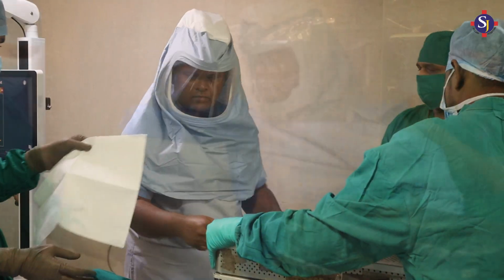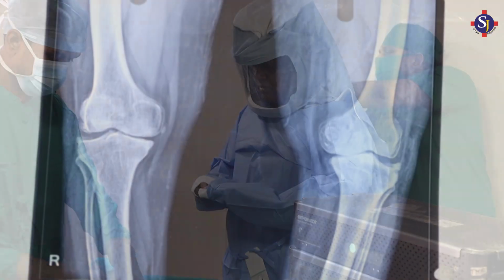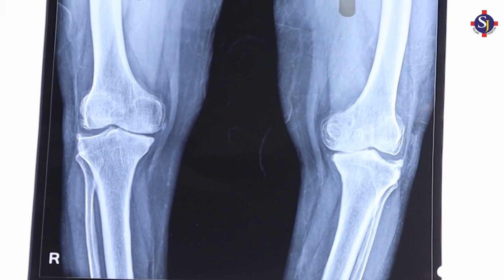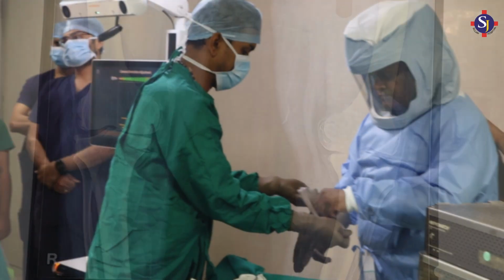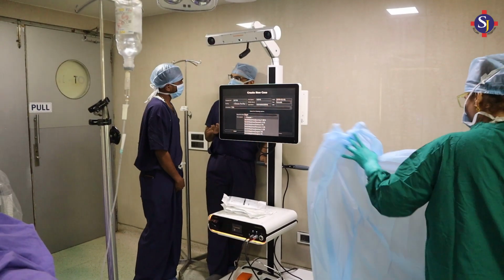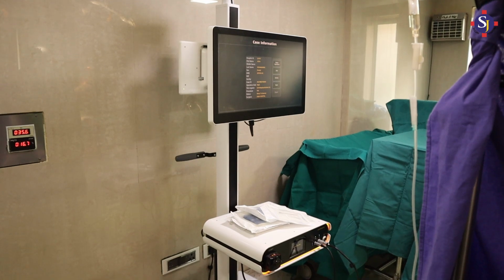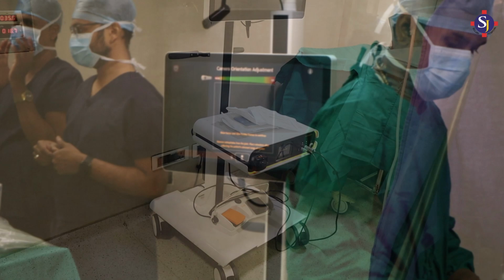Today we are going to operate on a bad knee which has end stage knee arthritis. This is the X-ray of this patient, which shows gross reduction in the joint space with irregular cartilage. The patient is in so much pain that the patient cannot even stand or walk. We are going to operate on this patient, and we'll go through the steps one by one. So this is the heart of the robot. This is the latest Cori robot, which has a screen, and on this all the readings are seen.